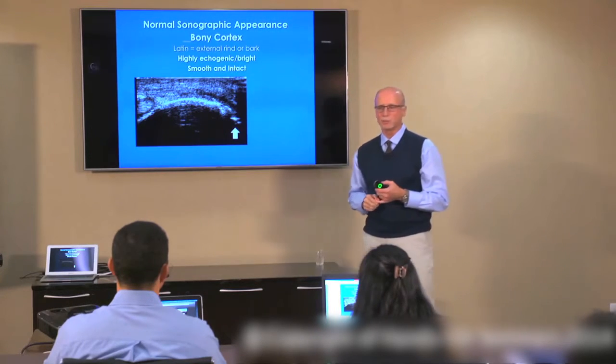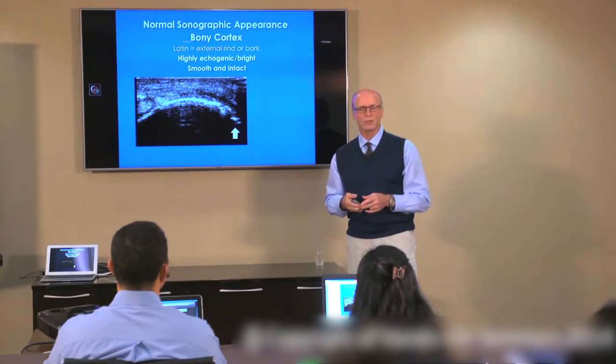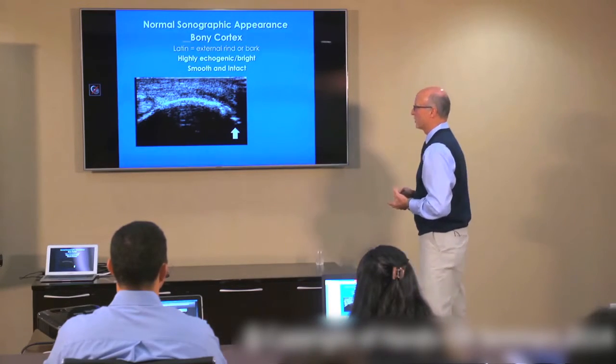It's also a nice representation of intra-articular joint degeneration. Rough, irregular bone inside a joint on an ultrasound image, DJD. Various forms, we can talk later on about symmetric, asymmetric, narrowing of a joint relative to the various arthritic conditions, but that's a nice representation of it right here.